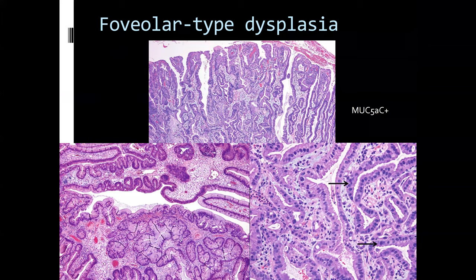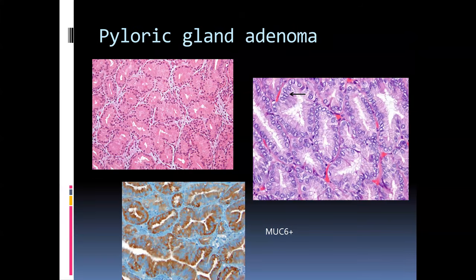Foveolar-type dysplasia is a slightly different and more subtle animal. It looks very much like foveolar cells with some basal orientation, but notice we start to see nuclear heterogeneity — a few macronuclei, a little crowding. These tend to be MUC5AC-positive on immunohistochemistry. You can see here this is a foveolar adenoma with foveolar-type dysplasia. Another adenoma without quite the same malignant risk is a pyloric gland adenoma — fairly typical pyloric-type glands with a little atypia, MUC6-positive, typically occurring in the pre-pyloric area.